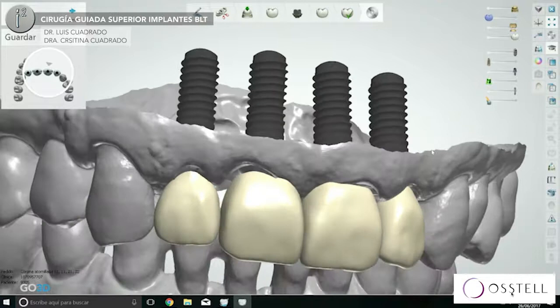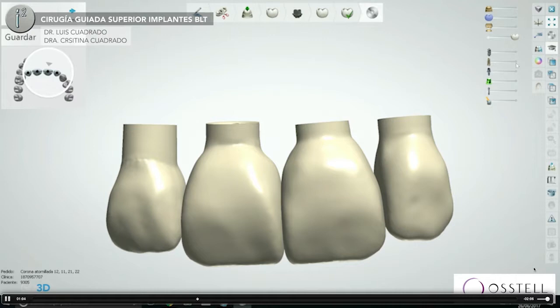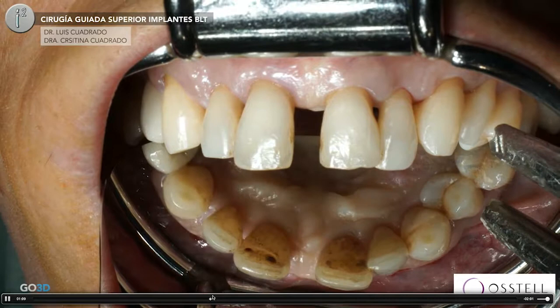I have my four implants and because I have my study model, the lab technician can mix both files and look for the better aesthetics from the patient based on the anatomy she has on the computer, on the different anatomies she has on the computer.